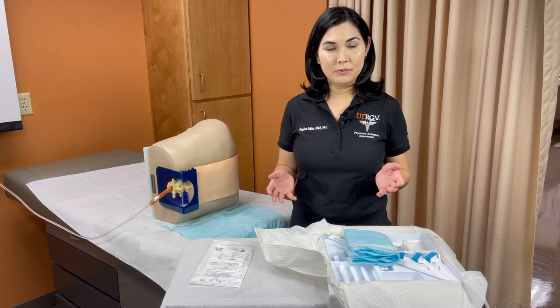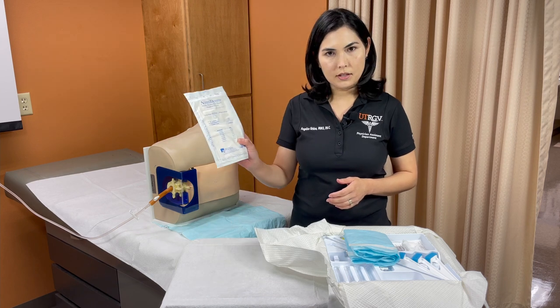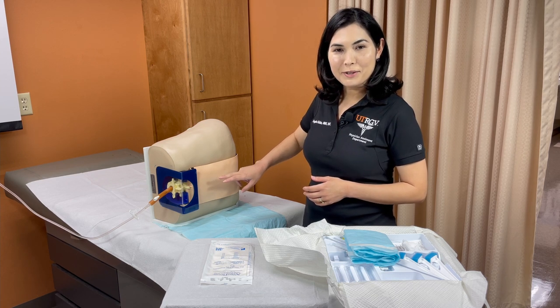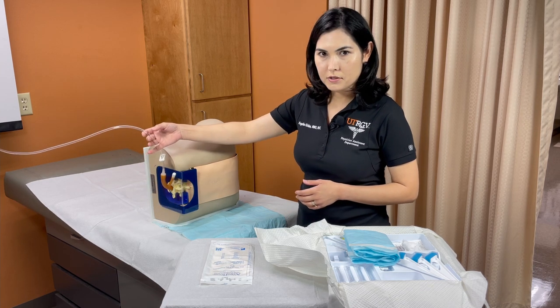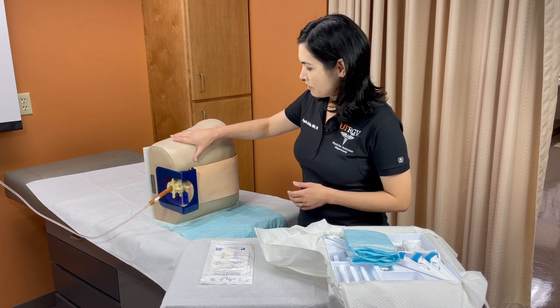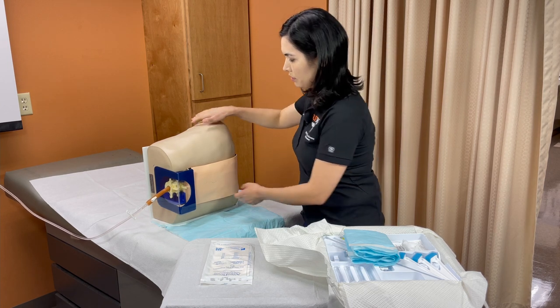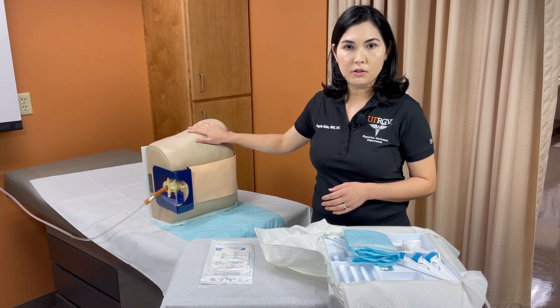When you come into the lab, you will have a lumbar puncture kit — which is what you see in this tray — and you'll need a pair of sterile gloves. You will also have the lumbar puncture model shown here. The model is set up to have some liquid, so you should see liquid return when you perform the lumbar puncture and get into the correct spot. You can also appreciate the iliac crest on the model — you can actually palpate it right here.